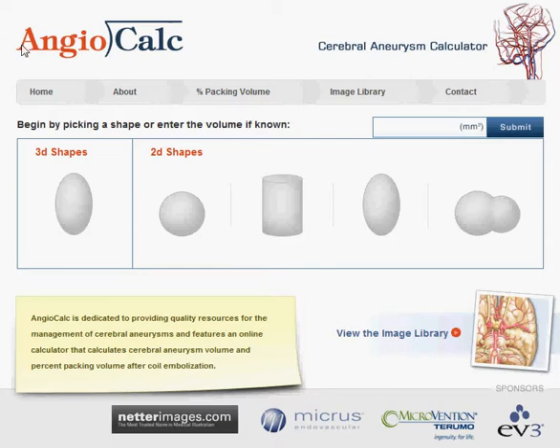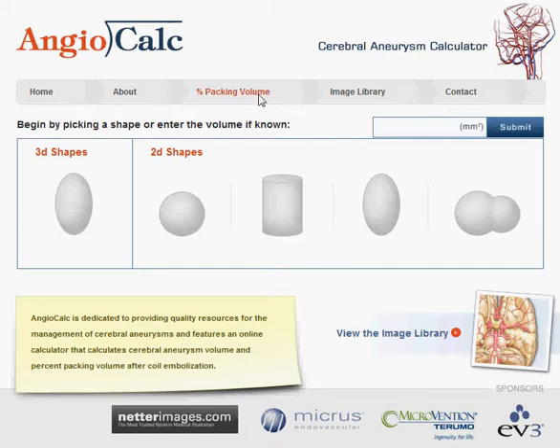This is the home page where you can begin by picking a shape, or enter the volume of the aneurysm if known. Enter that here and hit submit — that'll take you directly to the percent packing volume page. Otherwise, pick one of these five shapes.